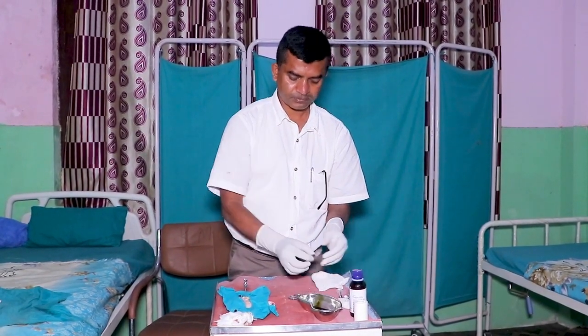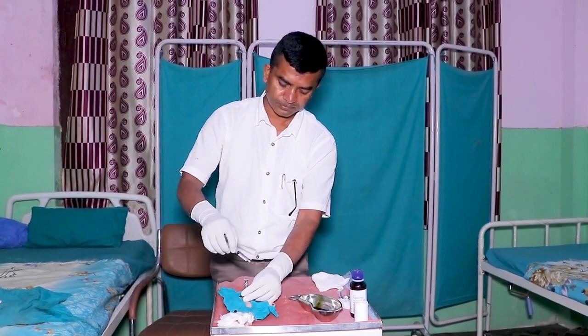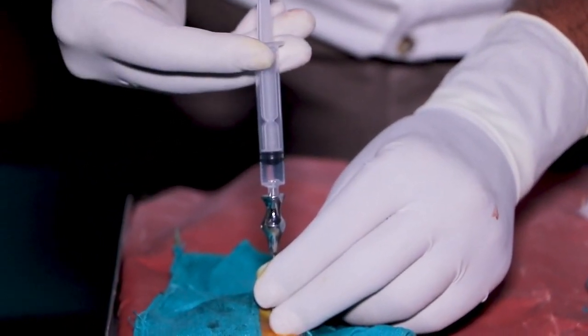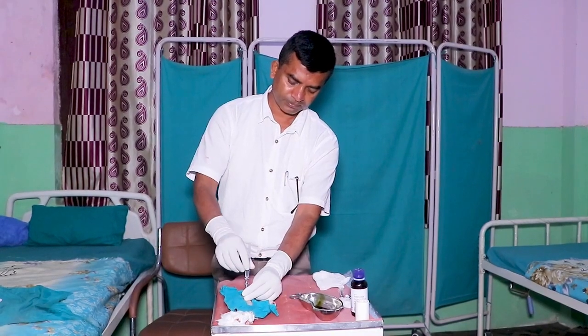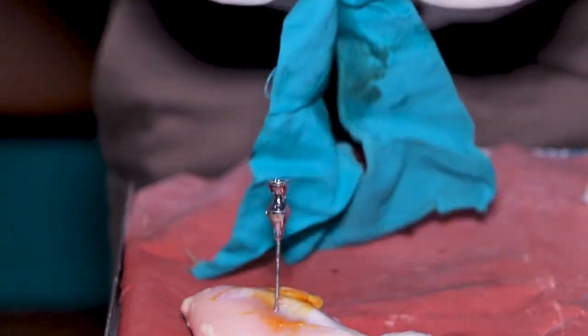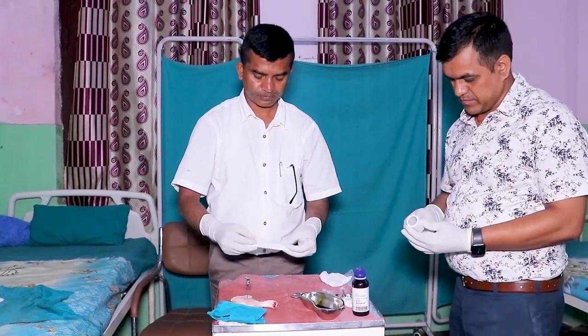Flush with 10 ml of normal saline. There should be no resistance. If resistance is encountered, reposition the needle slightly and attempt to flush again. If resistance still exists, remove the IO and attempt in a different site.